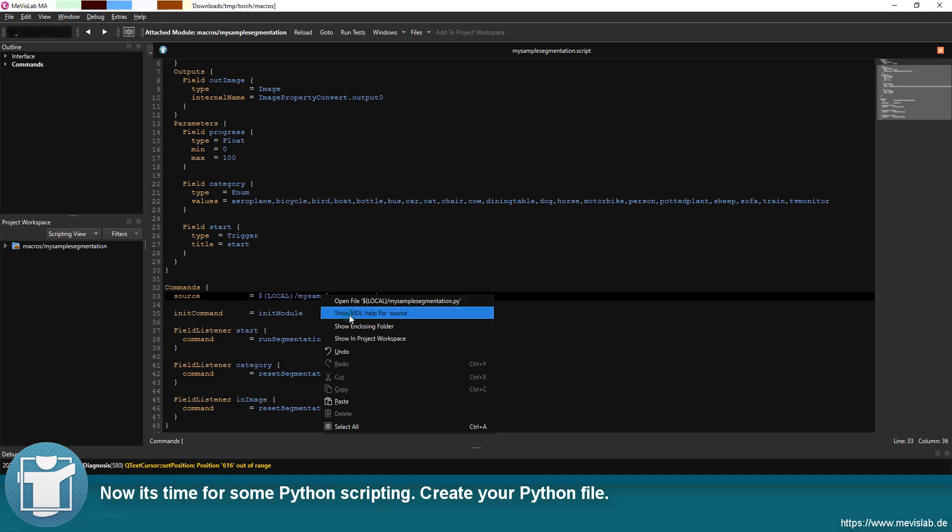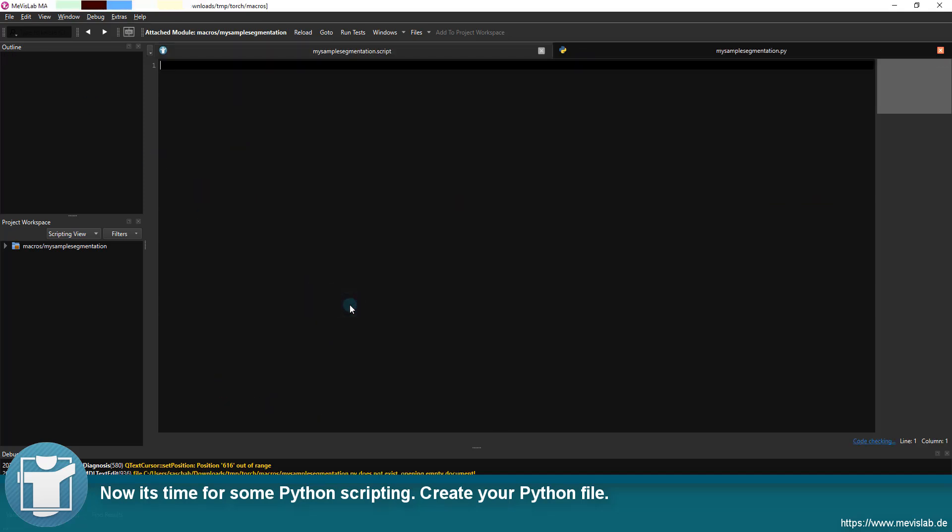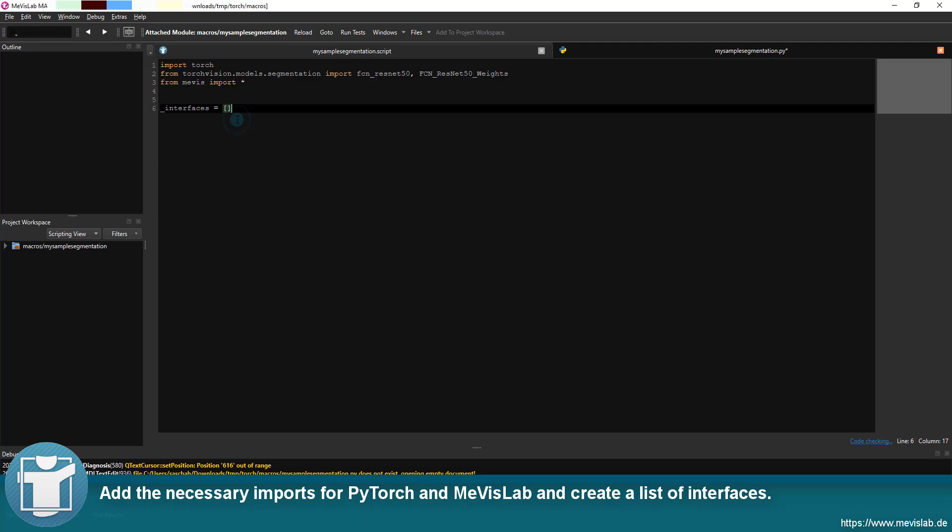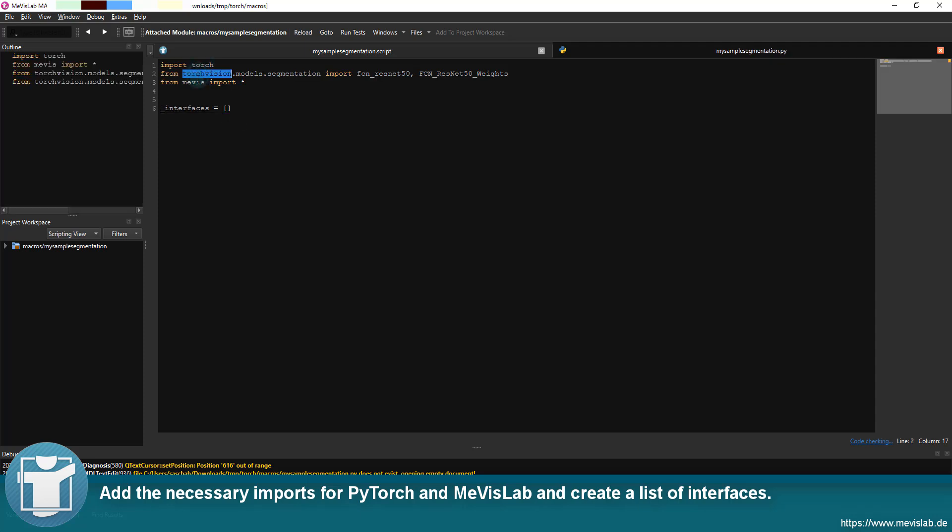Create your Python file. Add the necessary imports for PyTorch and Mevislab and create a list of interfaces.